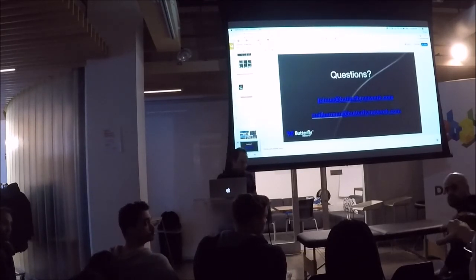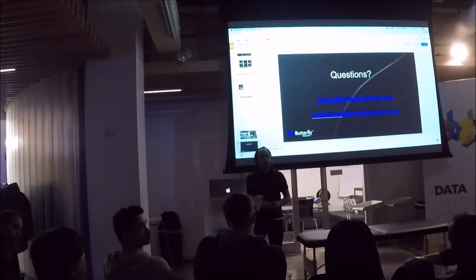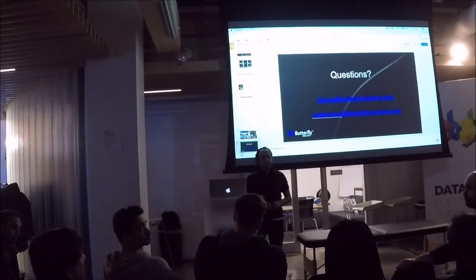An explanation regarding the picture that you put, red and blue, because somebody asked. If you're in the same vessel, the red is blood coming toward the transducer, the blue is blood going away. If there are two vessels, one is an artery, another one is a vein.